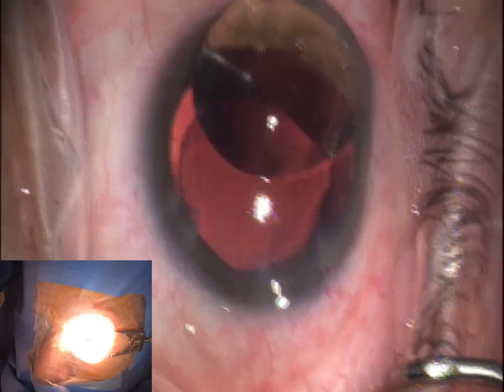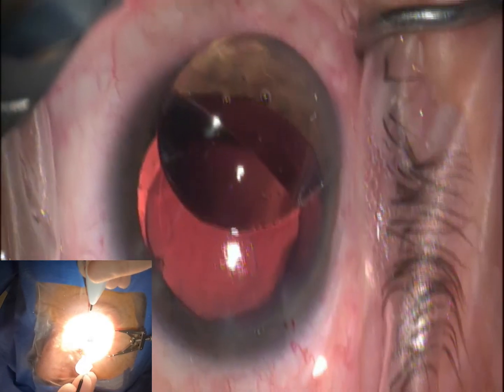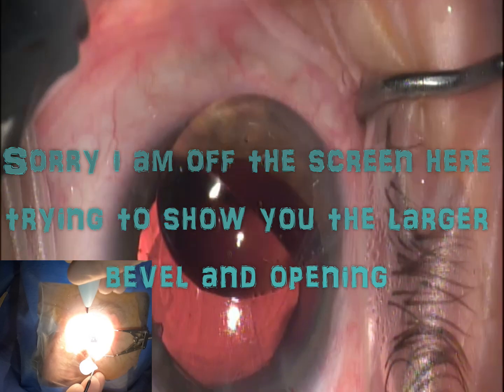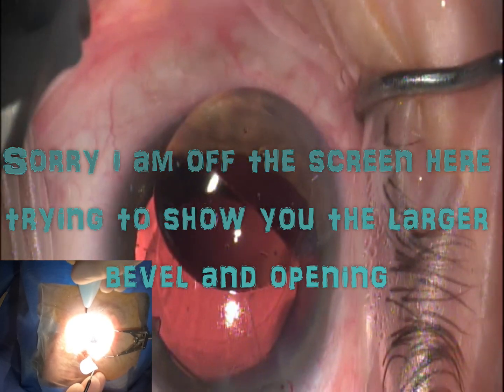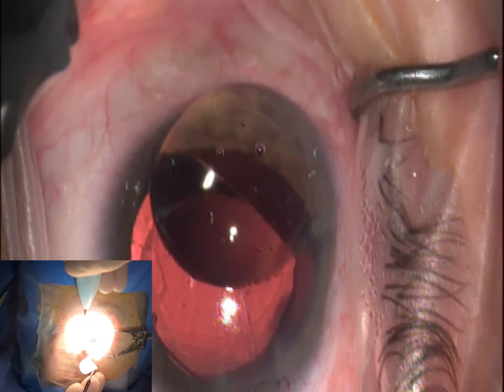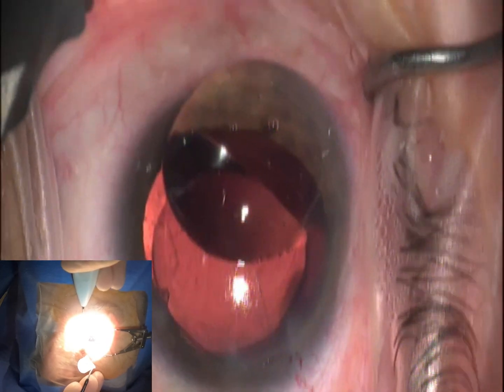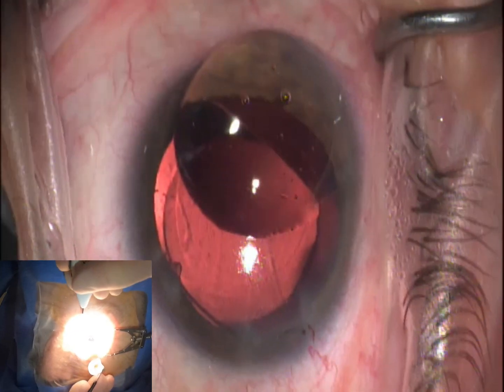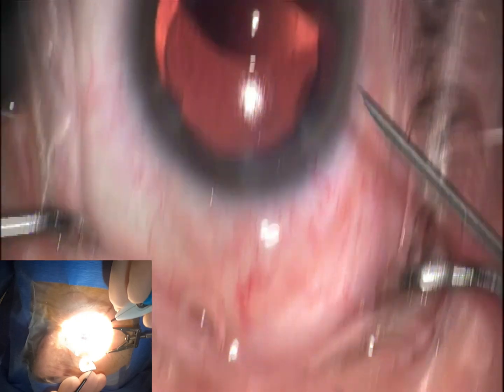Now we can see it over here — this is the new iStent inject W. A couple of things I want you to see: this is the new wide version of the stent, the bevel is a little bit bigger than the previous version. One thing I like to make sure I do before I ever inject one of these stents is pull back on the injector, visualize that needle tip, and move it forward again. This makes sure that mechanism is nice and smooth. I don't want to test this for the first time inside the eye — if it has any sticking components, I want to see that here, not in the eye. That movement felt really good.